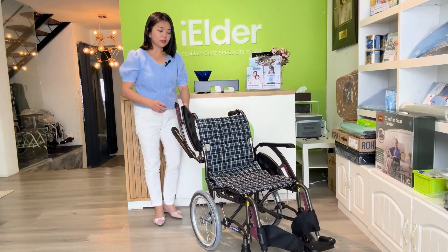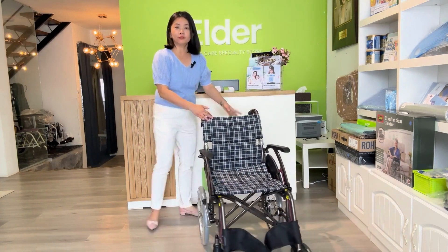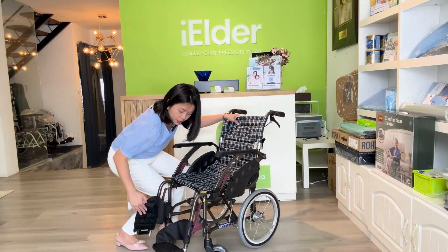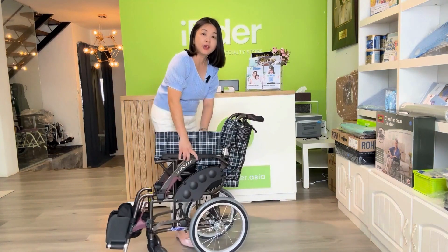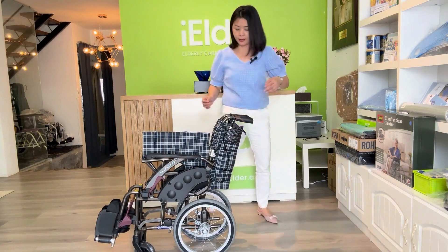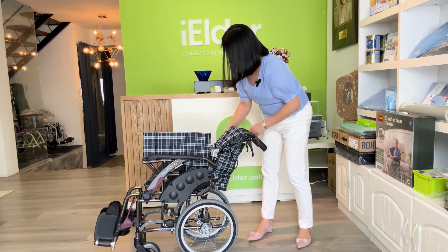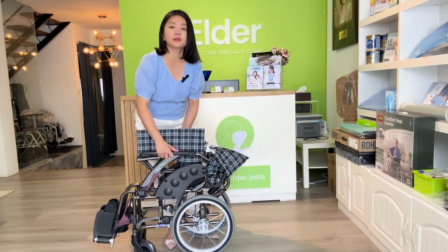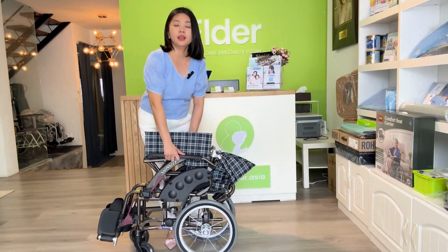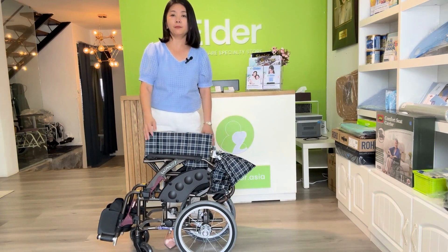Coming to portability, let me fold the wheelchair. It's very easy to fold — just press here — and it's very compact. I push the backrest down, and it is very lightweight at about 12 kg, making it easy for you to put into the car boot and travel to many places.